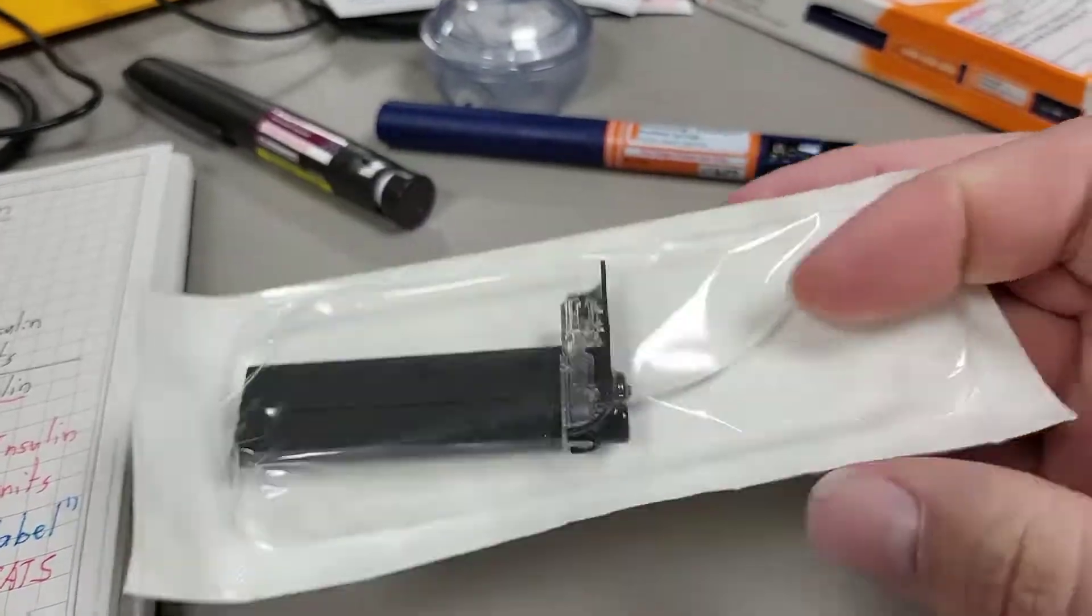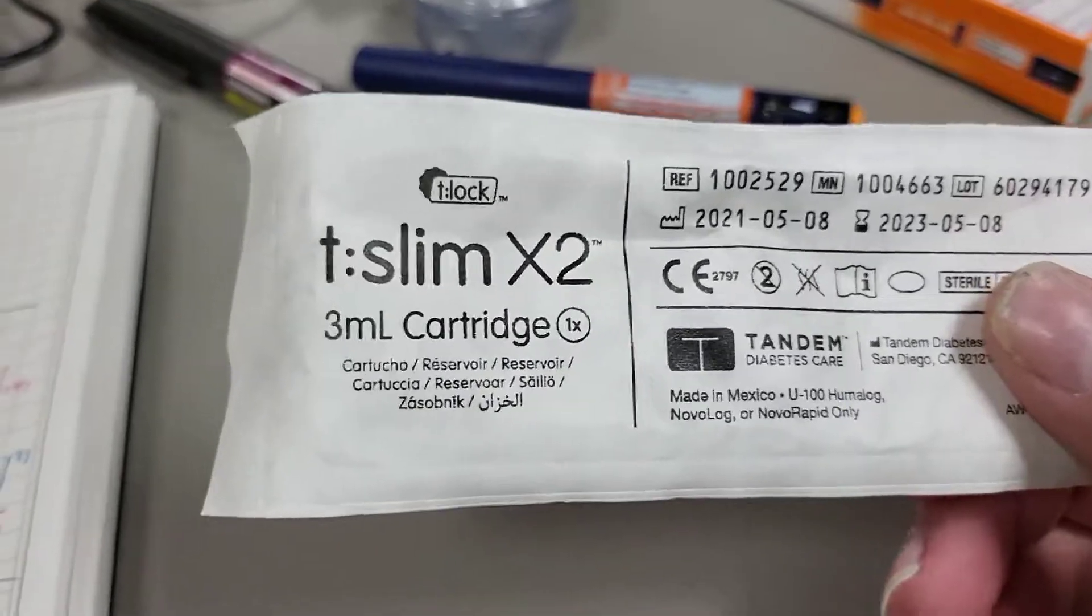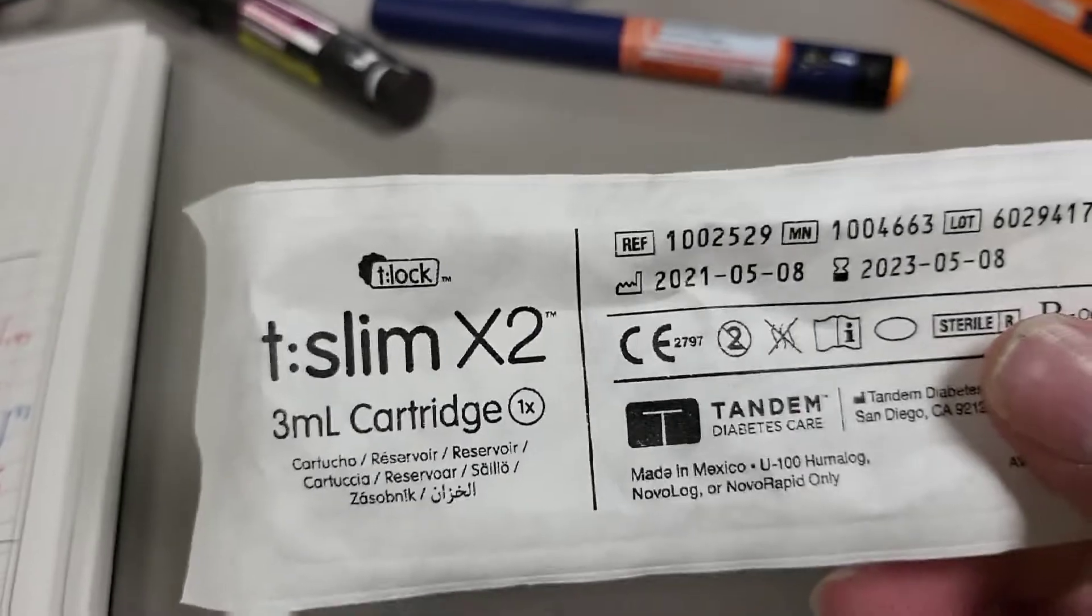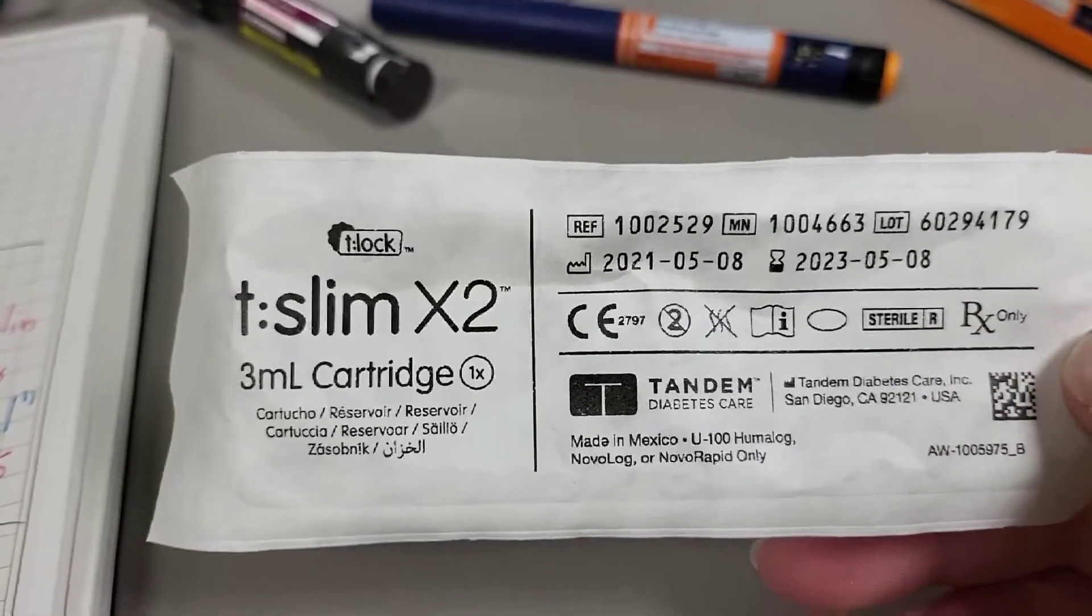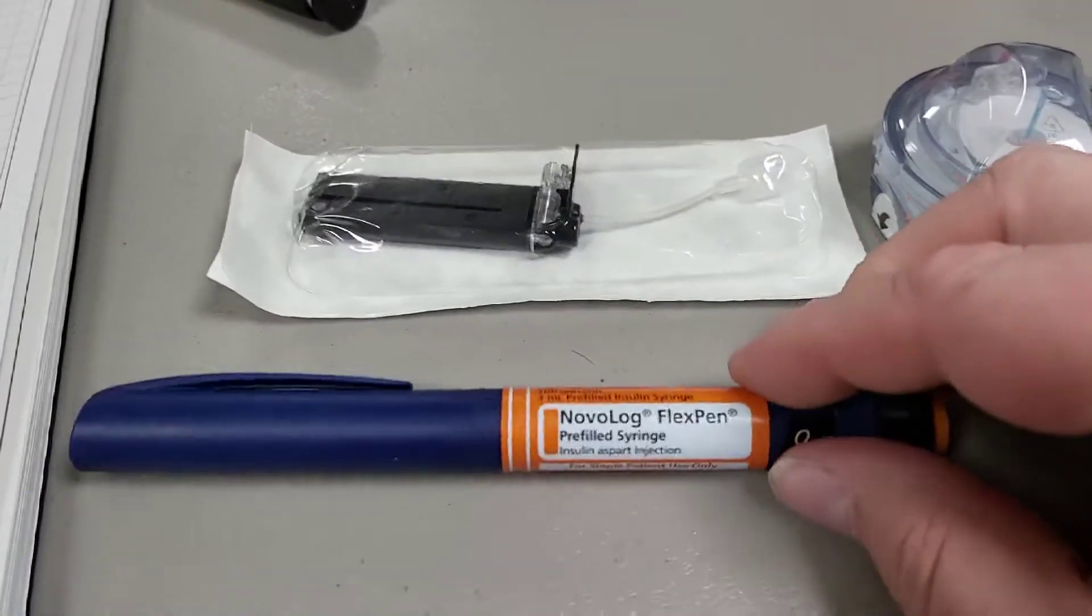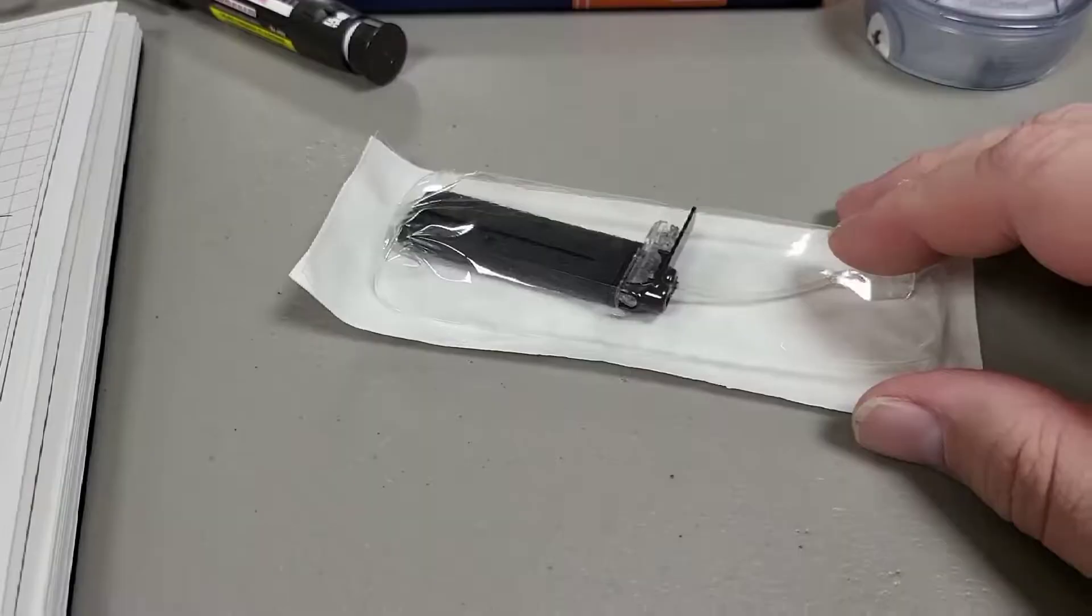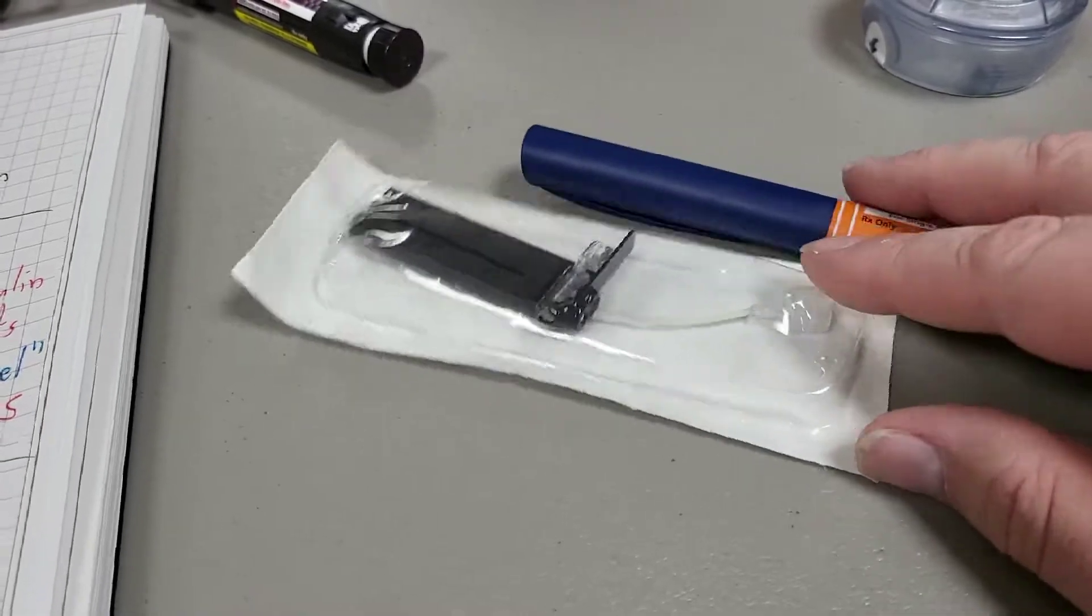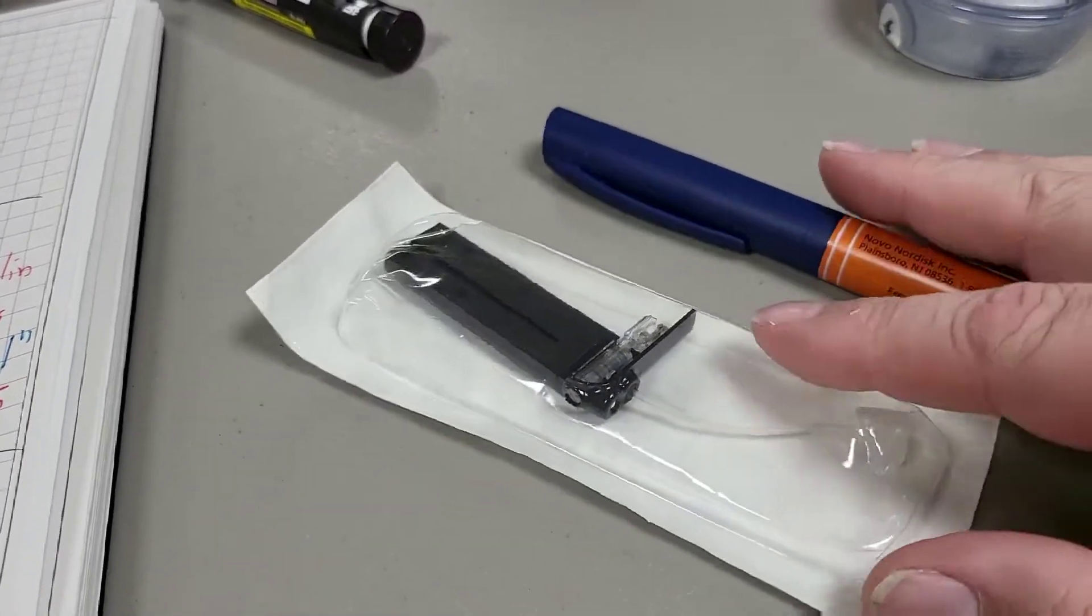It is a cartridge for an insulin pump. Notice it contains three milliliters per cartridge. That matches the quantity in the pen. If I were to fill this cartridge with this pen, I would be having to change my cartridges every one and a half days.